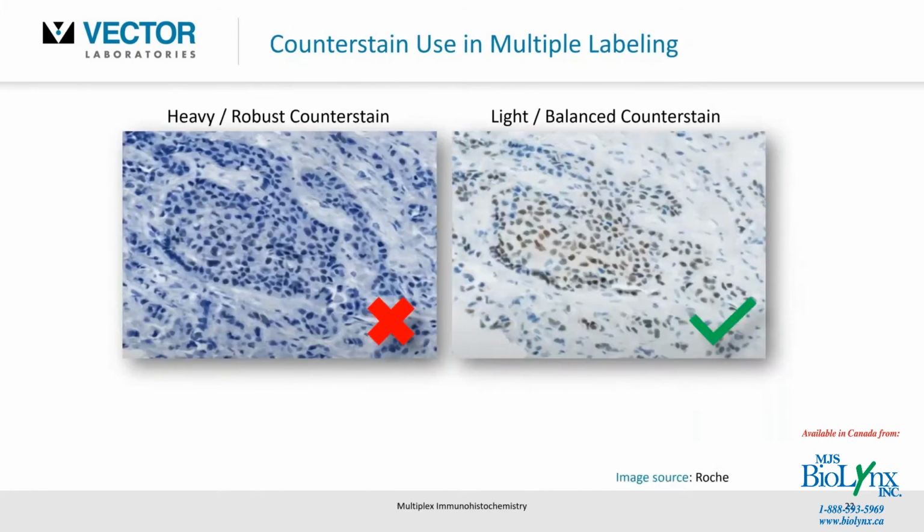I'm just going to hammer this point a little bit because I feel this is very important. A lot of people just haphazardly throw a counterstain on, and you can really ruin a lot of hard work by doing that.